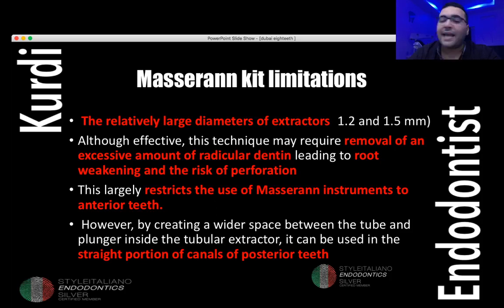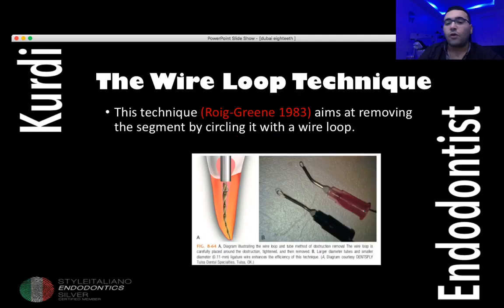So, in the past, the Masserann kit, yes, it was a good technique, but it was very aggressive to be used. That's why it was only used in anterior teeth or even in posterior teeth in straight canals. But most probably the files will not break in straight big canals.